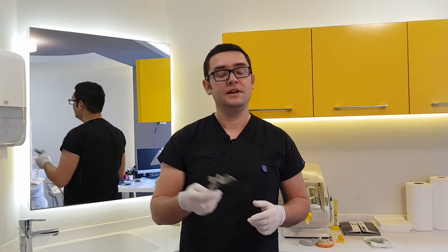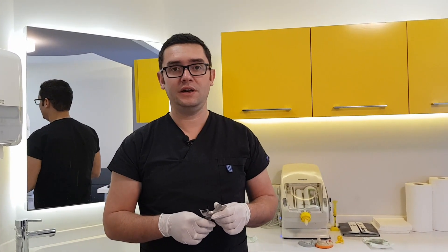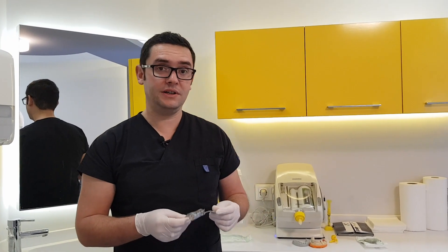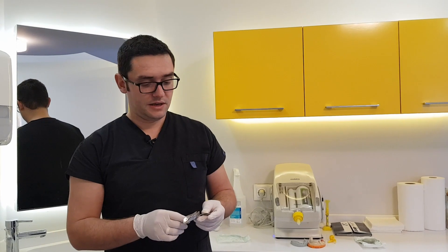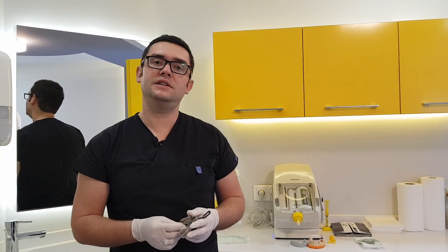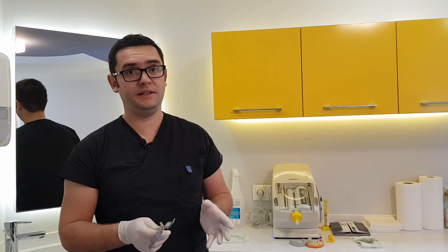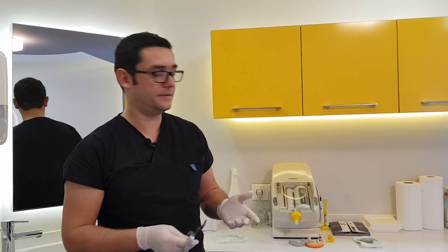To do it, I am going to take an analog impression from my patient. This is an impression tray. I am going to fill it with an impression material. We use different impression materials in dentistry. I am going to use a silicone material which is used for veneer restorations.